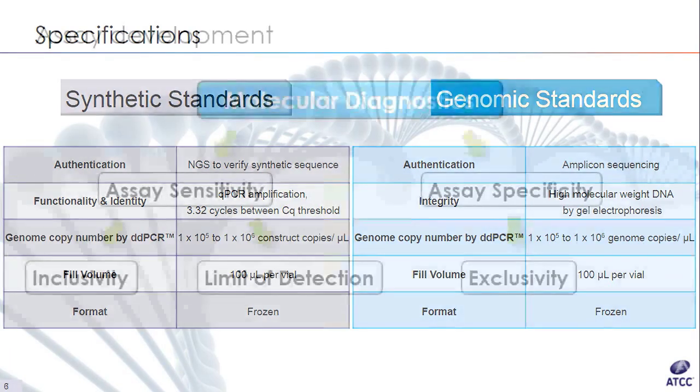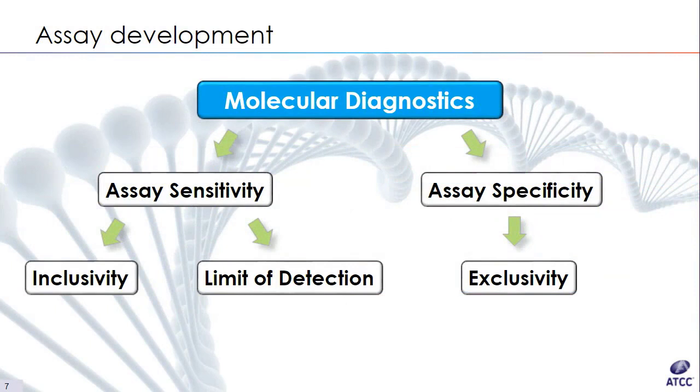The molecular standards are of primary utility in the development, verification, validation, or control of a molecular diagnostic assay, one that employs next-generation sequencing, or more commonly, a nucleic acid amplification test, like PCR or an isothermal protocol. The slide I'm showing now is a diagram of some of the major points on the development side of a molecular diagnostics assay. Once the target organisms and basic type of assay to be used are identified, the two major categories of design and experimentation are for sensitivity and specificity.